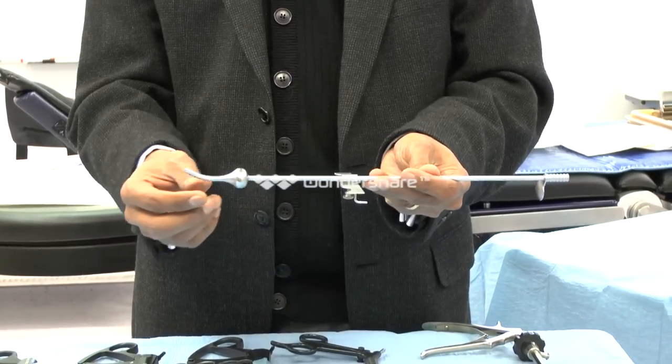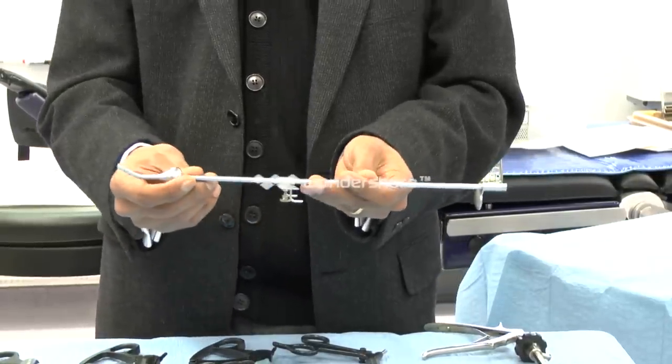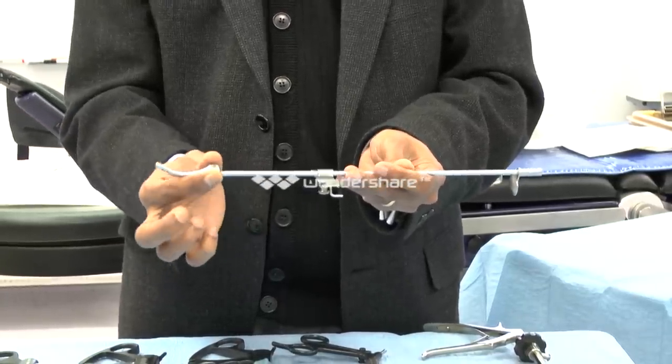These do come in different sizes. This one is a fixed length, assuming a fixed length to the cervical canal, but there are also disposable uterine manipulators which allow you to adjust the length with a rubber obturator.